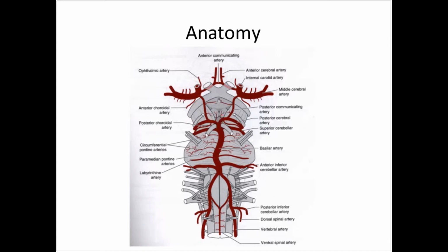However, the middle cerebral arteries and the vertebral arteries and the basilar artery are not part of the circle of Willis. The ACOM joins the right and left brain, and as you can see, the A2 segments, which are beyond the ACOM, cannot be insonated by TCD because of the angle of the vessels.